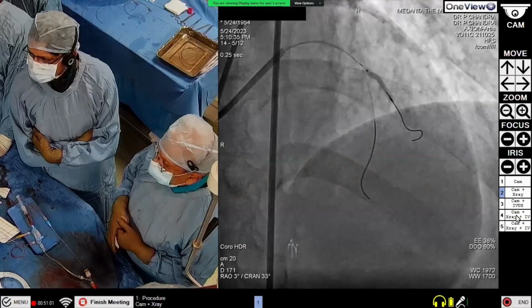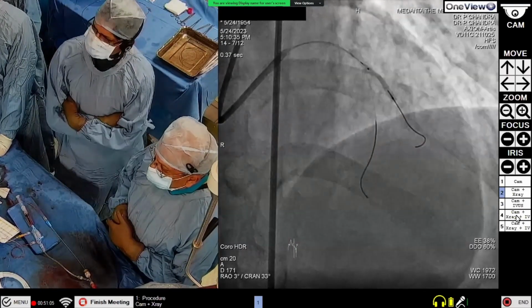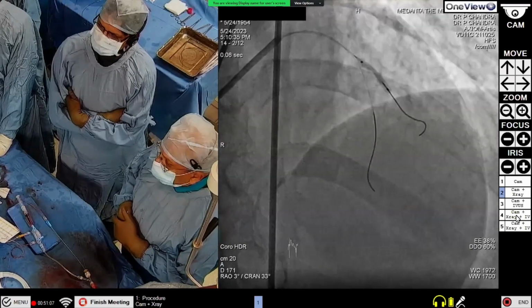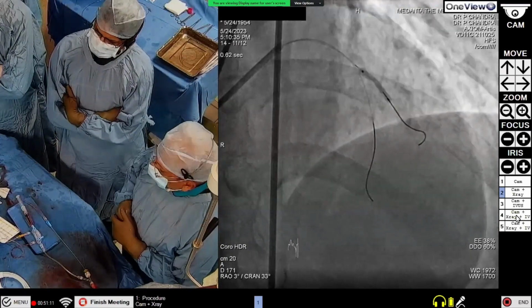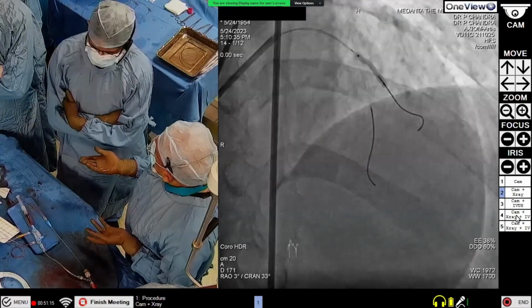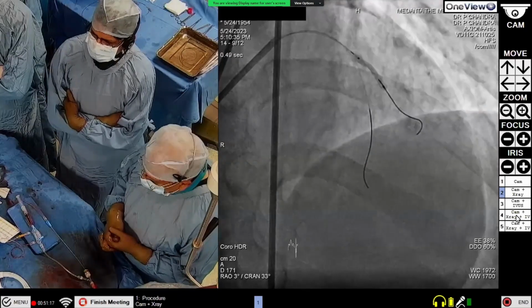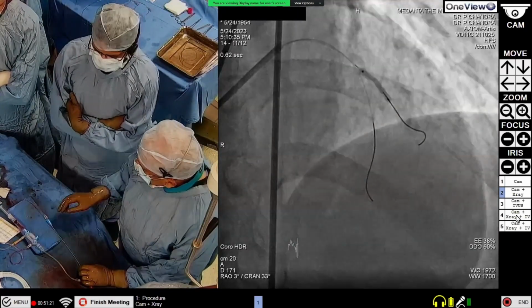So in these patients, we started doing this, and with that, everything became very predictable. And these results are very predictable. We call that if you don't put a stent, there is no stent thrombosis. And for the future also, if there is some lesion after 10 years, the vessels are still there for any kind of future vessel treatment.